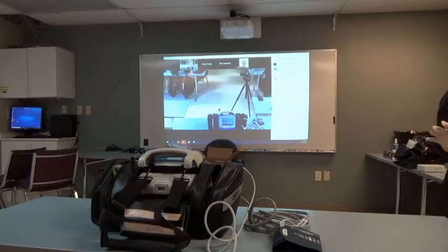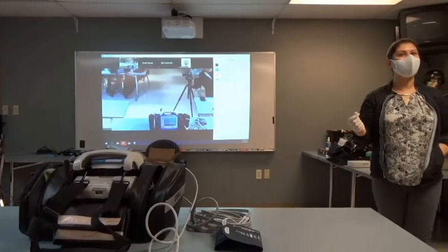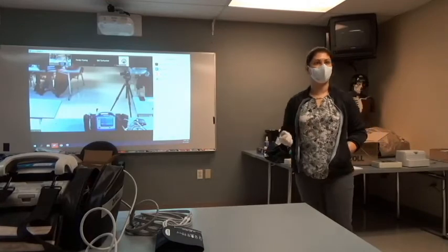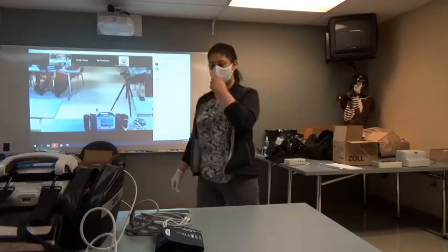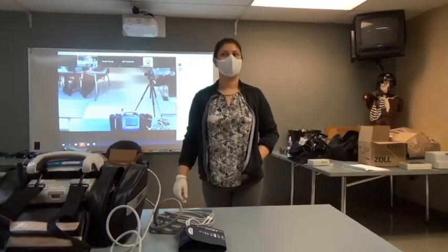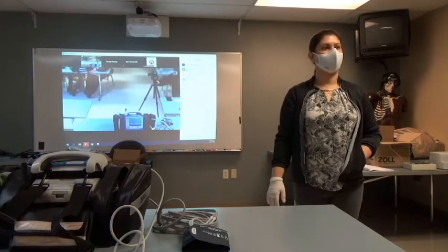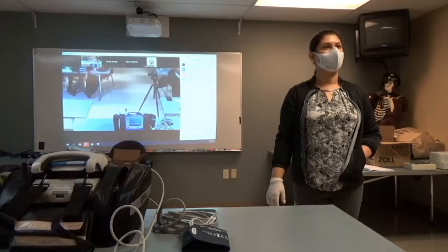Okay, great. So, do you guys want to run through that one more time, just to be sure? Okay, so we're going to go ahead and hit analyze to get into AED mode. Attach. You'll follow directions. Stand clear. Just so you know, we usually don't use press. Right, I was asked to teach on it. And then it gives you the 2 minutes. And it's counting.